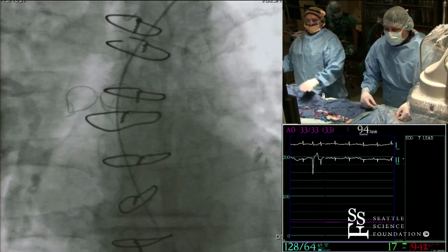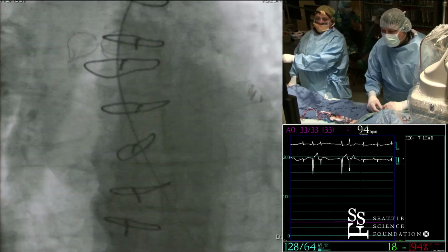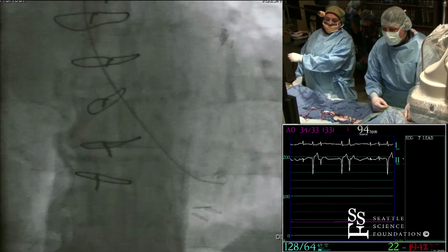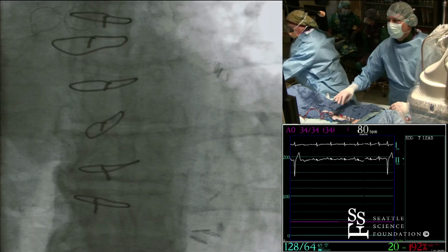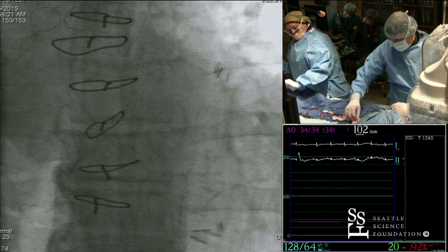And there, okay, did I go into the ventricle? Yes, you did. I want to measure that gradient. There's never a bad move. It's just an opportunity.